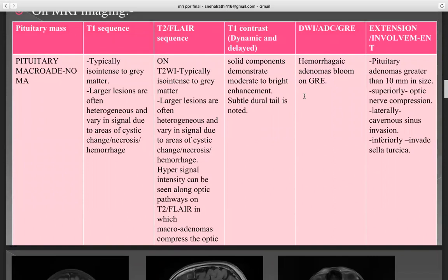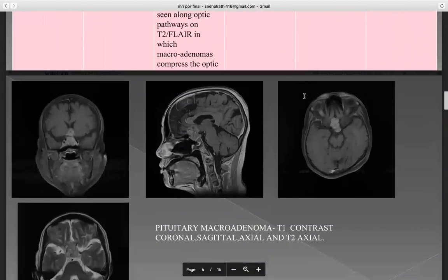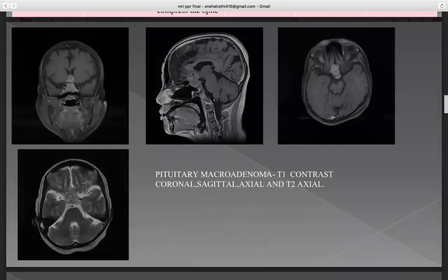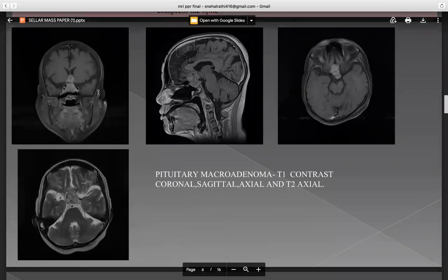Regarding extension and involvement: pituitary adenomas greater than 10 mm in size can extend superiorly causing optic nerve compression, laterally with cavernous sinus invasion, and inferiorly invading the sella turcica. Following are the images of pituitary macroadenoma — T1 contrast coronal, sagittal image, and T2 axial.